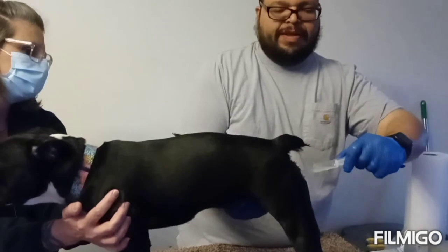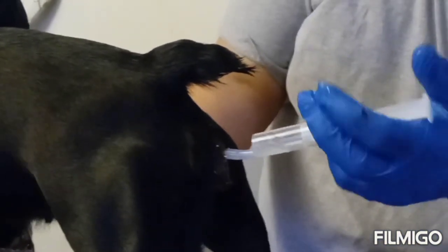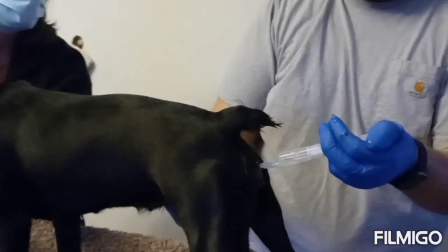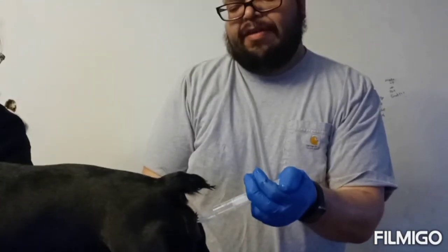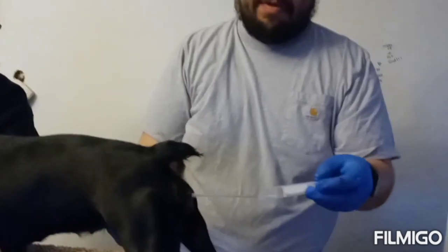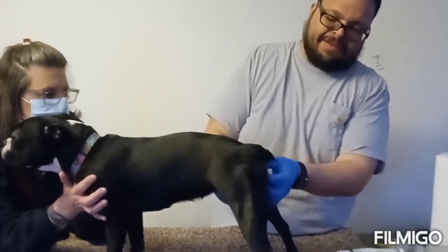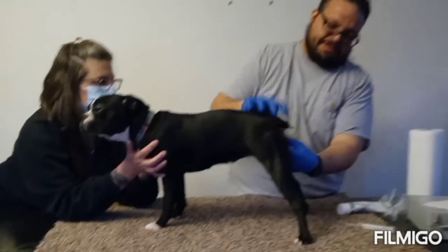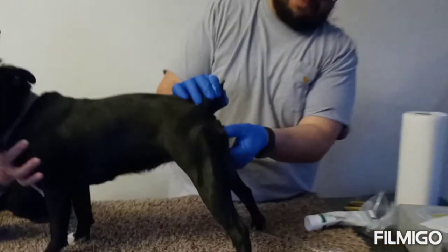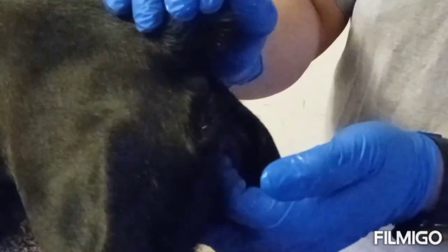You can tell she's completely fine with it — it's not really hurting her. She's in heat and she is receptive. That's why you put air at the top: to clear the straw and get it all pushed in. Then you pull out and keep her elevated for a little bit — about 15 minutes. Just kind of massage the area and make sure that she's contracting, which you'll be able to feel. You can see right here she's contracting, and that means she's pulling all that semen inside — you want to make sure she does that.